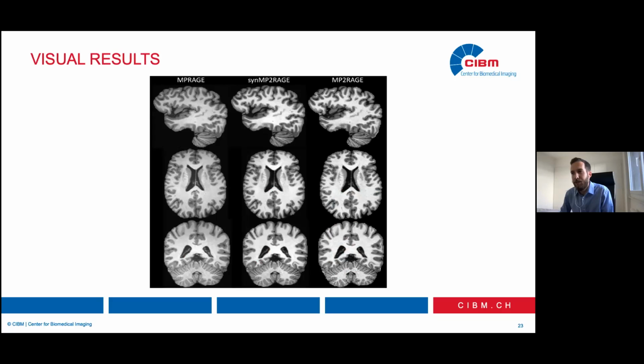We did not. I used the bias field correction for the ANTs tissue segmentation, as it requires that the images have been previously corrected. But I did not apply a correction before feeding to the GAN. I also experimented with some bias field data augmentation to see if that would help remove more bias field. That did not bring conclusive results, but could be a way also to remove it more in the output. There is still some bias field remaining. You can also see maybe a bit here, slightly, a difference in the white matter values. Thank you. Yeah, of course.